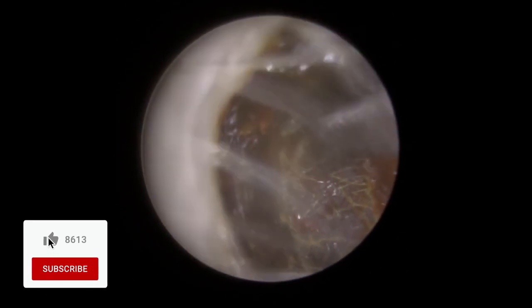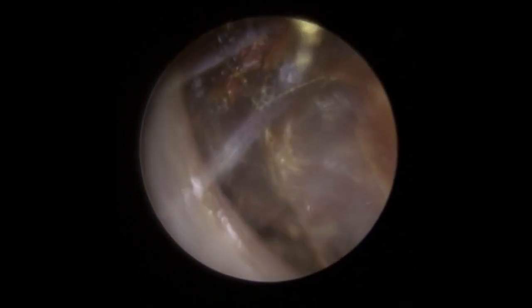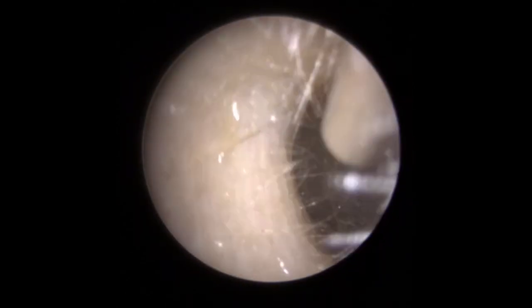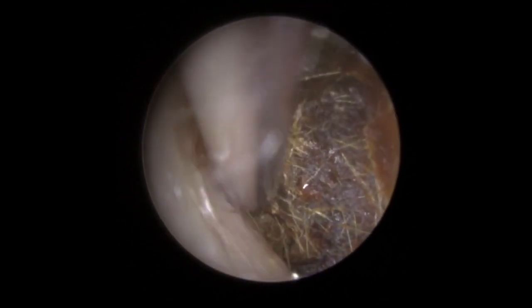I can see there's a small gap up there, but it's whether it's big enough to get the jaws of the forceps around it. I'm just trying at the moment to gently pull it down. See how the whole thing is moving there? It's really pushing further in. Now that deeper section I pointed out at the beginning is going to be pushed right up against the eardrum, which means we can't really go digging at this. We have to gently pull it away or mould it and unpeel it from the canal walls. The crocodile forceps struggled to get above and below it, so I'm just aiming the fine end in here to see if we can move any of these outer sections away from the canal wall to get a good grip.